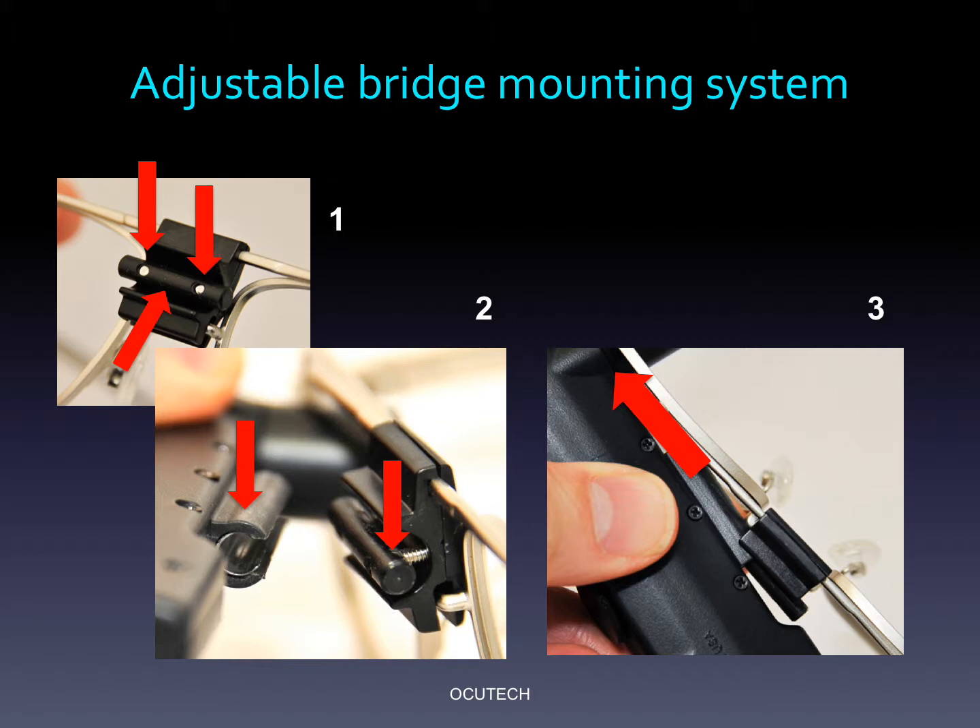Be careful not to loosen the screws too much to avoid disengaging them from the positioning rod. On occasion, and especially with smaller eye-sized frames, you may have to bend the frame slightly to completely disengage the telescope from the positioning rod. Once you've got the telescope positioned properly, just tighten the screws until they are snug and the telescope does not move. There is no need to over-tighten the screws.